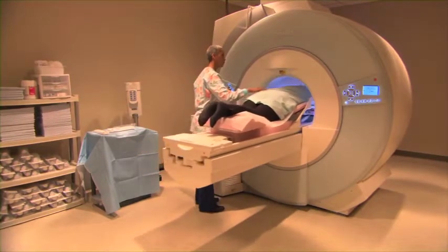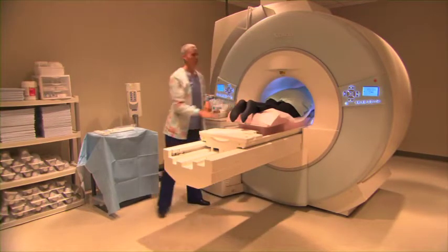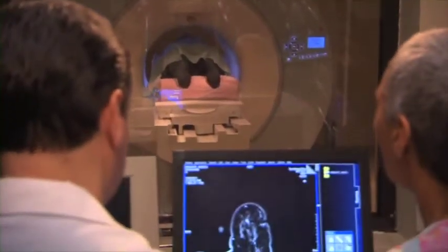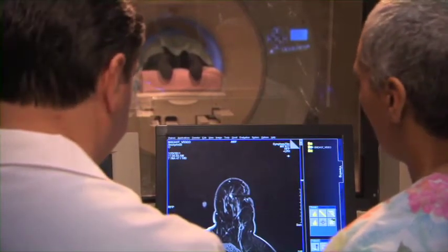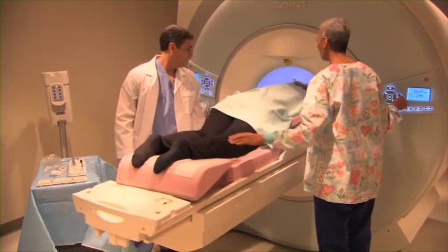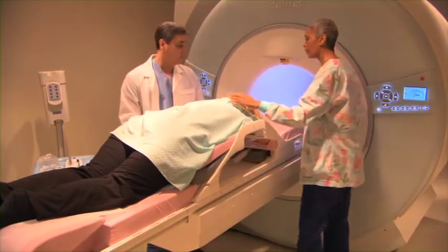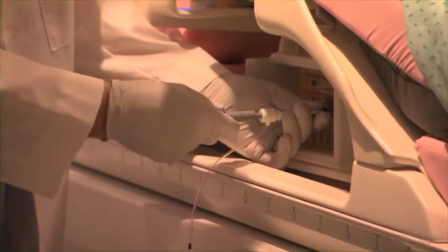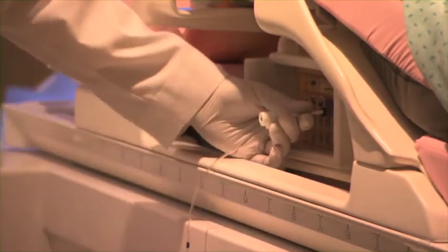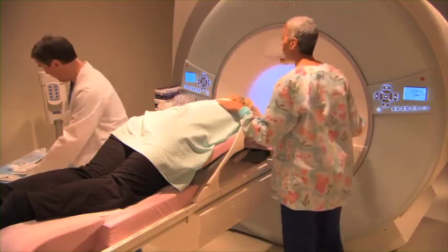Next, she'll move you into the MRI magnet to take some preliminary targeting images. These images will help guide your physician to the exact spot where the tissue sample needs to be taken. Next, your physician will come into the room and explain what's happening. They will clean and numb your breast prior to making a small incision, and then place a targeting tool called an obturator, which visibly confirms positioning in the MRI scan. Then it's back into the magnet for a set of confirmation images.